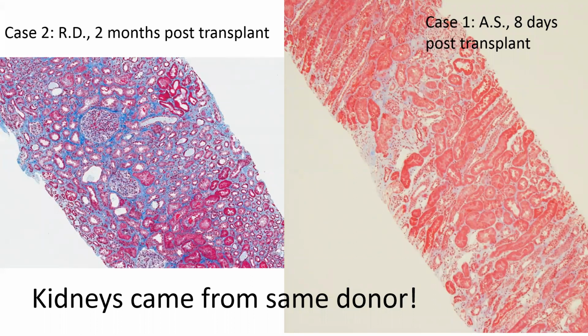Right. Yeah. I guess I would also add to that, it would help case 1 itself because of the considerations of circulating factors, including immunoglobulins or stimulation of complement in the setting of some other factor. That's true. Yeah. All right. Yeah, I'll see if we still have tissue.